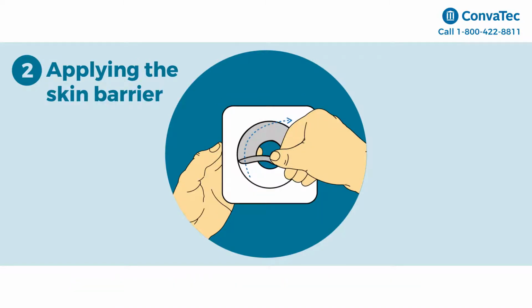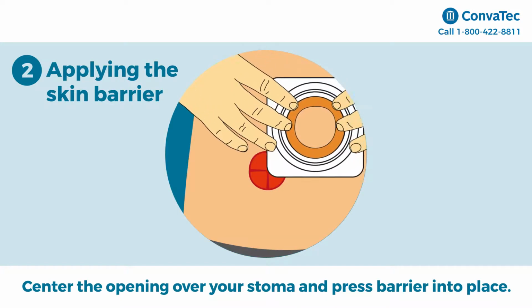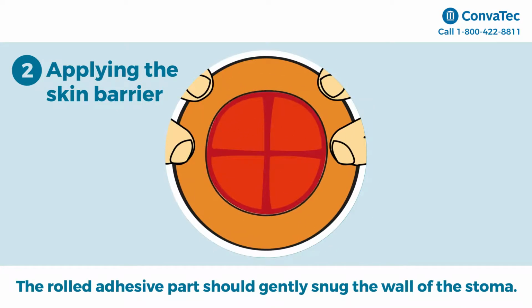Step 2. Applying the skin barrier to your skin. Find the blue tab and remove the clear release liner from the skin barrier. Immediately center the opening over your stoma and press the skin barrier into place. The rolled adhesive part should gently snug the wall of the stoma.